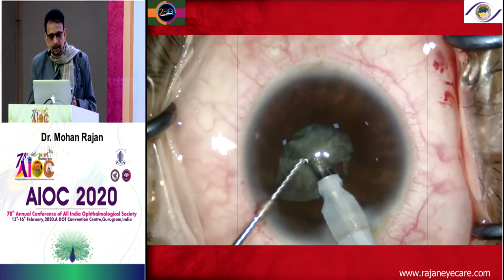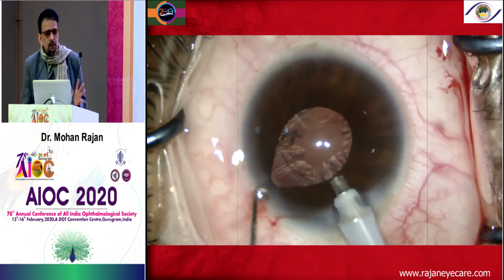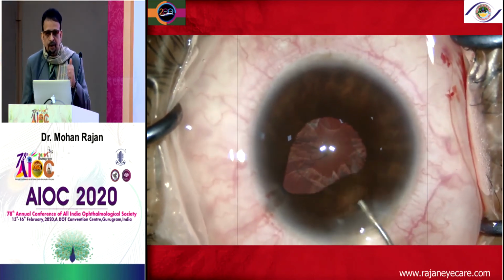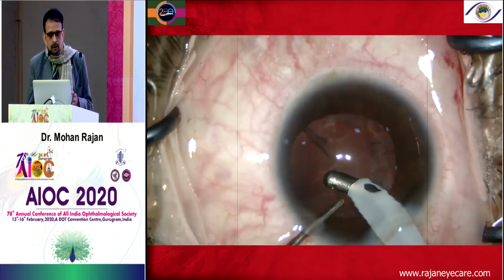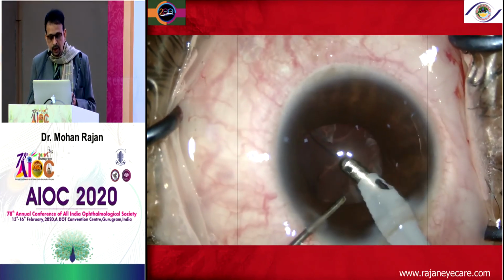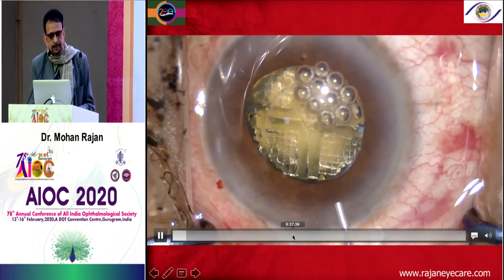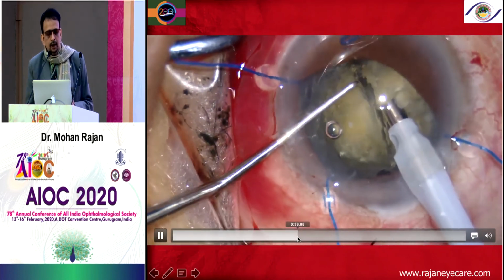And again, when the pupil starts coming down, the worst problem in phacoemulsification or any cataract surgery is the small pupil. If you have a small pupil, you're not able to see well, and you will have all the complications. And once you have an IFIS like this, I always immediately put iris hooks and go ahead with the patient.